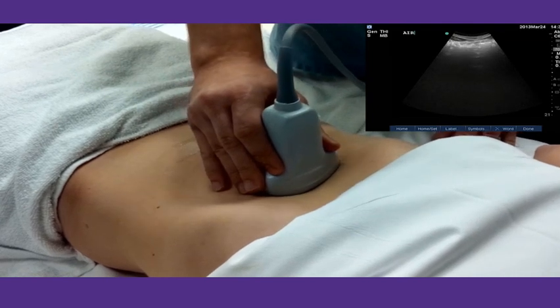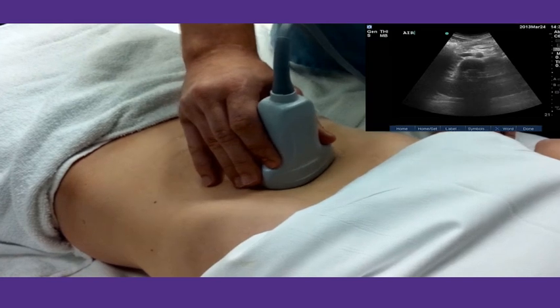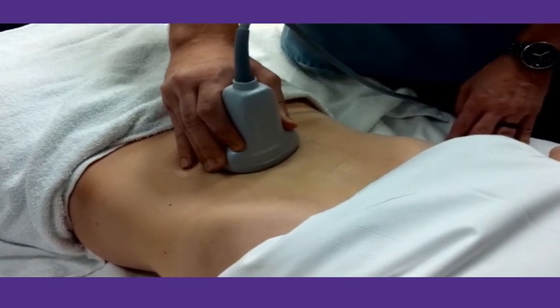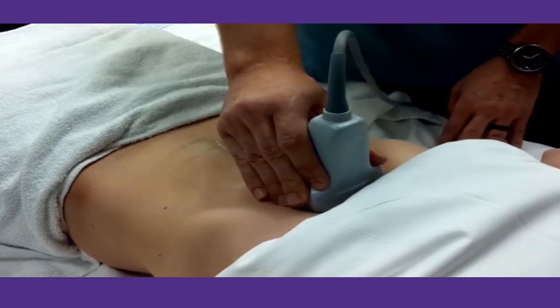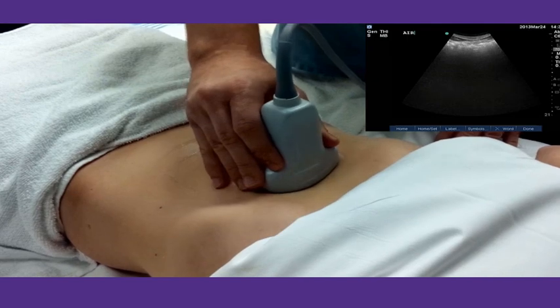If the aorta does appear, attempt to keep that pressure and continue the scan towards its bifurcation. If this technique is not working and is repeated without effect, try adding the second technique of asking the patient to inhale and exhale. Here, when the patient takes a breath in, you might catch a glimpse of the aorta.